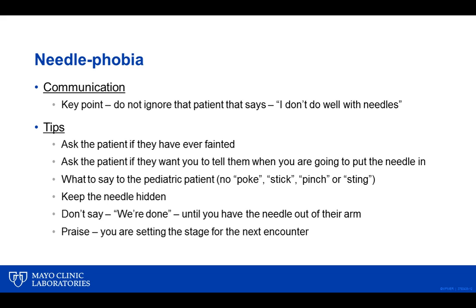Keep the needle hidden. When I say that, don't uncap the needle out in front of them and stand there and hold it so they can see it. Just keep it off to the side so they don't focus on that needle and it scares them. Don't tell them you're done until you've popped the tourniquet and taken that needle out of the patient's arm. Patients raise their arms up like, thank God it's over.